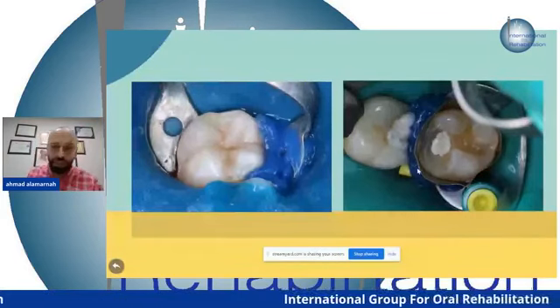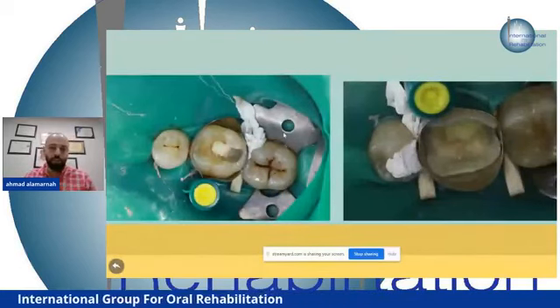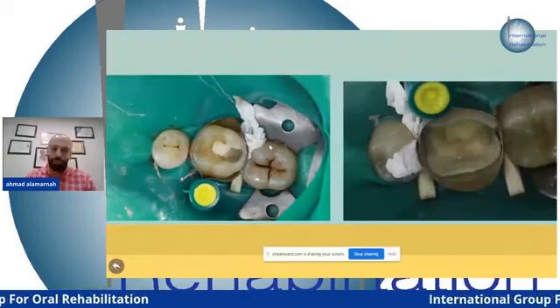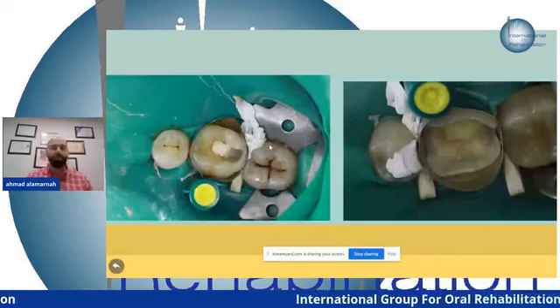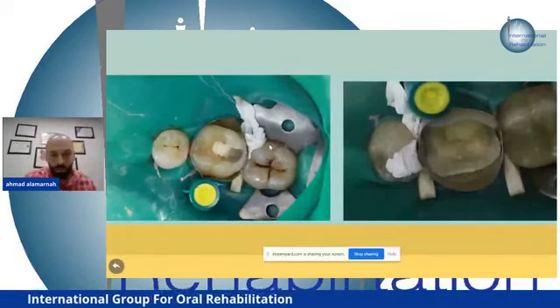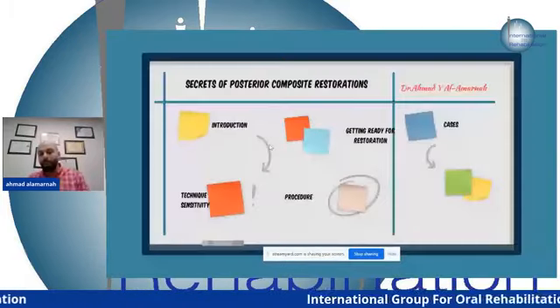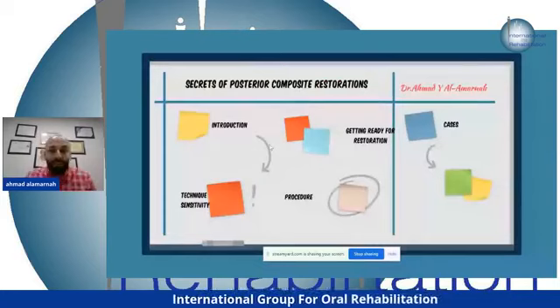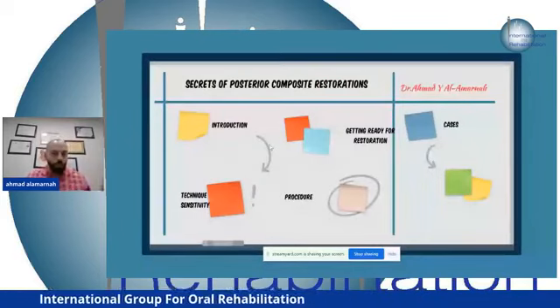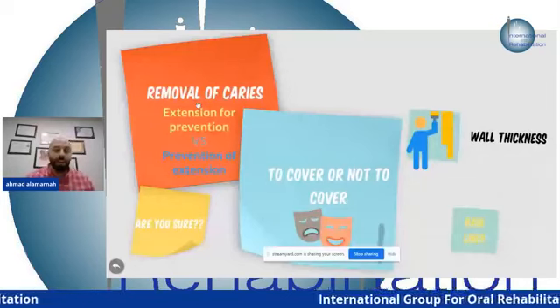Okay, and I can also use Teflon here. Those samples, you can use in different ways. You can use it instead of dental floss also. This is for the technique sensitivity. Now we are getting ready for our restoration. We do our preparation, so we remove the caries.